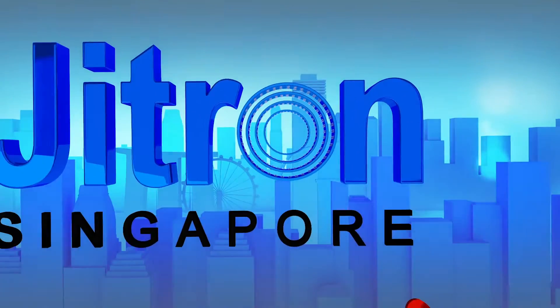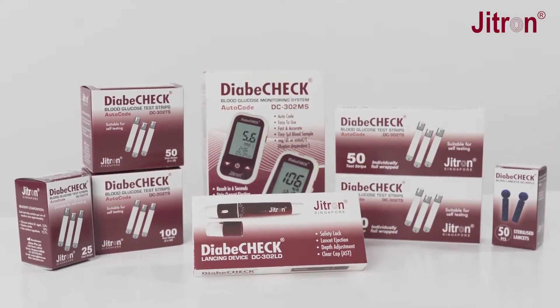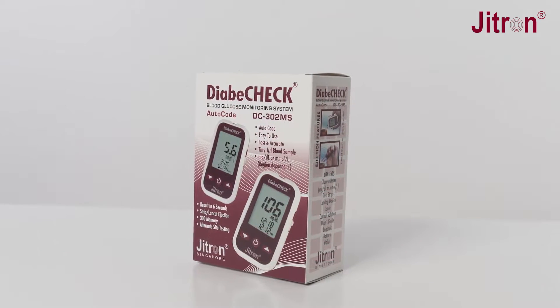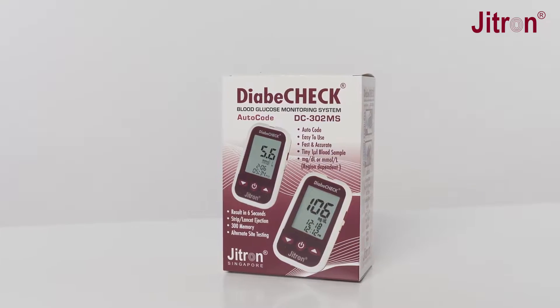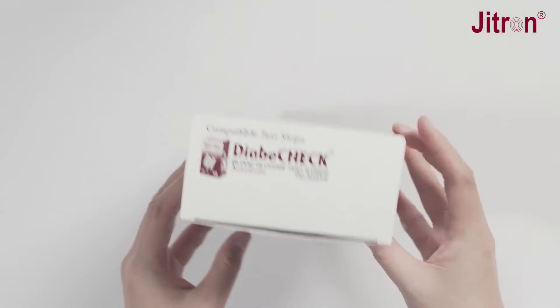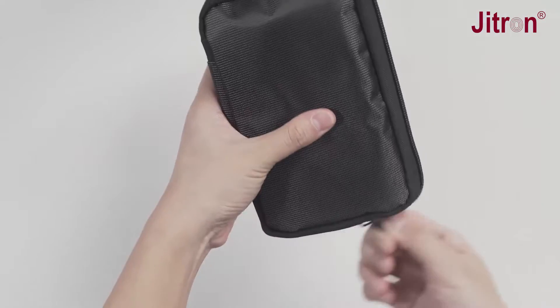JITRON Singapore — Live with Confidence. Thank you for choosing the JITRON Diabicheck Blood Glucose Monitoring System DC302MS. This video provides the important steps which help you to test your blood glucose level.